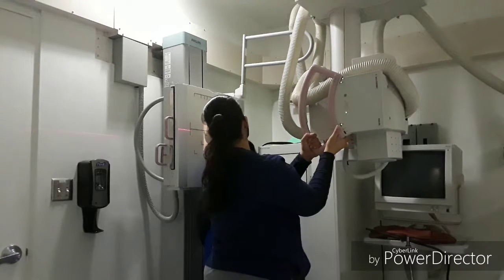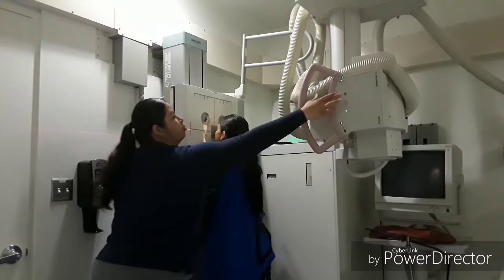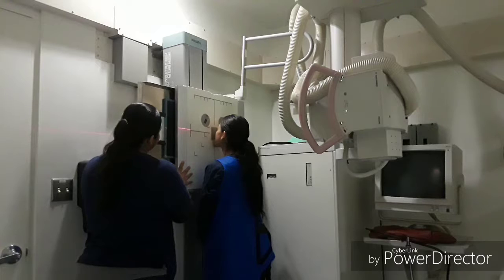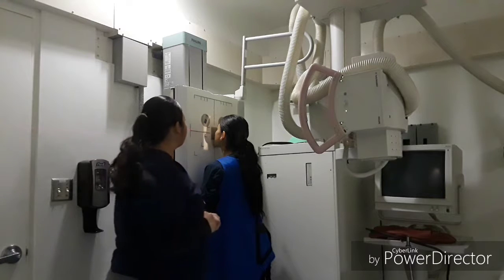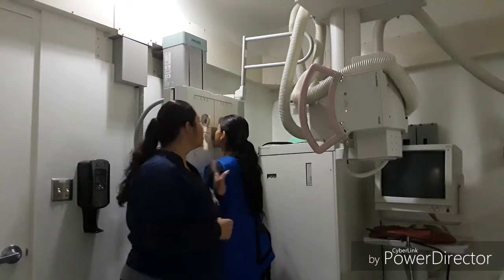But since every patient's anatomy is different, I am not going to do exactly at the acanthion, since I would cut off a bit of the frontal sinuses. So I would have my patient stop breathing, take my exposure, breathe and relax easy.